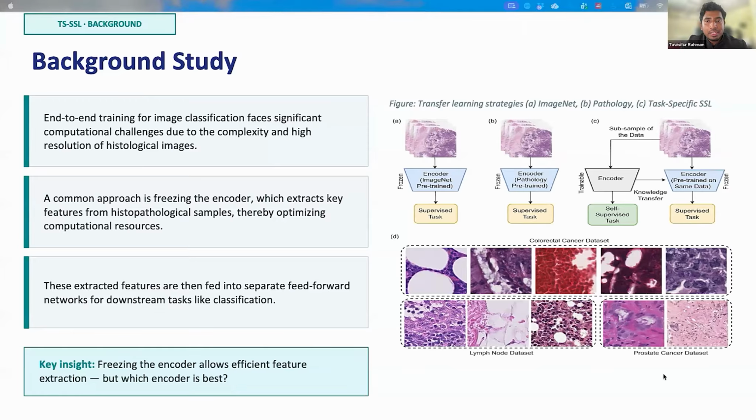If I give some background: in computational pathology, because of its gigapixel images, when they started AI in this domain, they used ImageNet pre-trained encoders to extract the features from the patches, like ResNet 50 or some other pre-trained CNN. In the last few years, some foundation models have been developed by researchers, and they started using foundation models pre-trained on pathology images.